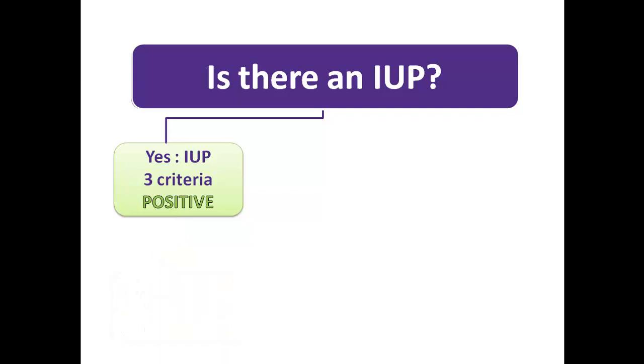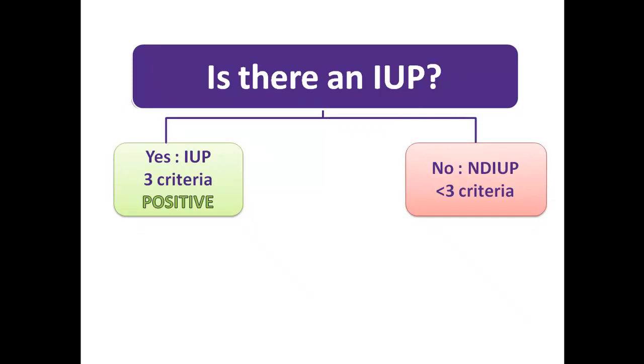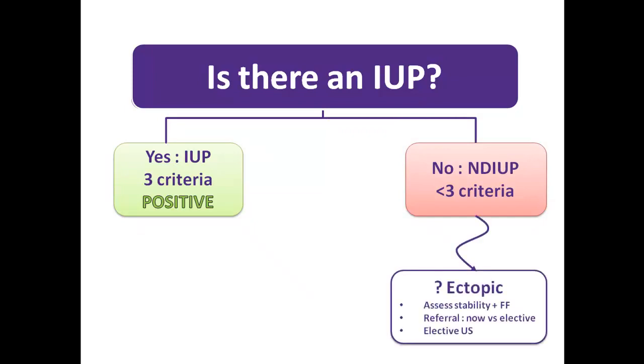If we can clearly see the entire uterus, but not meet the criteria to be certain that there is an IUP, then we interpret our scan as NDIUP. In this case, the broader clinical picture must be considered and the potential risk of ectopic must weigh into the decision making. Is the patient stable? Do they have free fluid in the pelvis or the upper quadrants? Are there concerning features that merit immediate referral? Can this patient be managed as an outpatient? We will tease out some of these decision pathways in a subsequent screencast, although as always, clinical suspicion and concern reigns supreme in these matters.